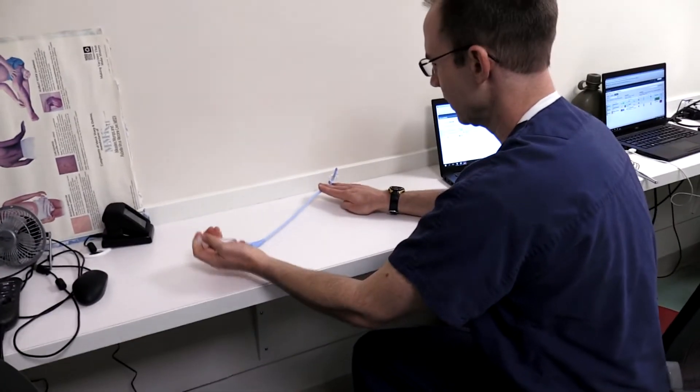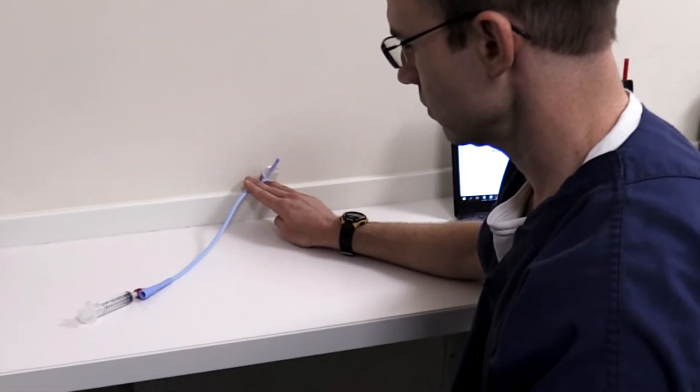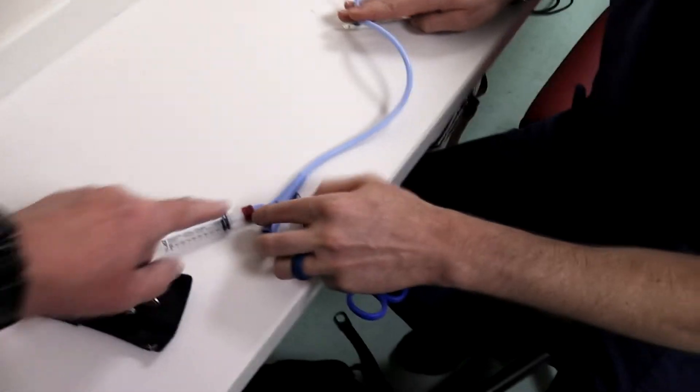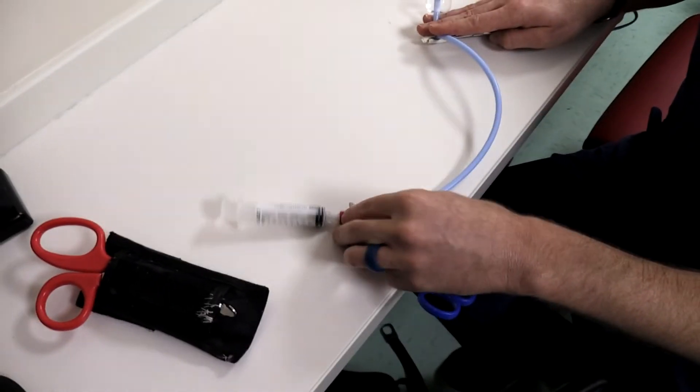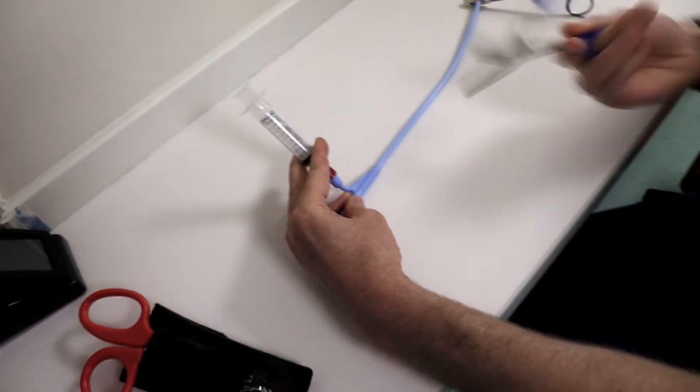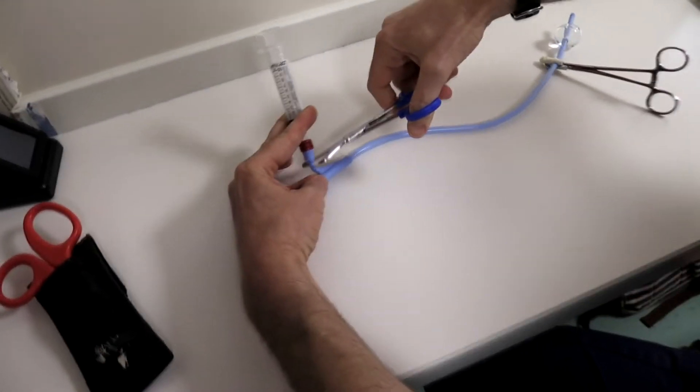So what do we do about this? If the valve is stuck, what you'll need is some scissors — you can cut just above that valve. Unable to aspirate after advancing, so we're going to go ahead and cut the line.